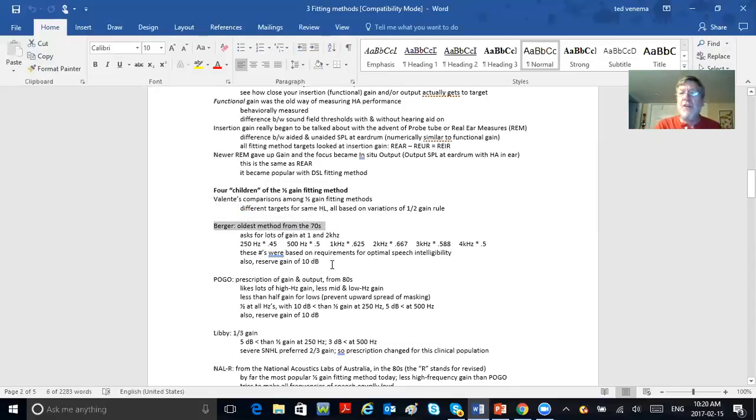lots of gain at 1,000 and 2,000 hertz. 250 hertz, multiply the threshold by 0.45. 500 hertz, multiply the threshold by a half. 1,000 hertz, multiply the threshold by a little bit more than half gain. 2,000 hertz, a little bit more than half gain. 3,000 hertz, still more than half gain. And at 4,000 hertz, half gain again. These numbers were based on the requirements for optimal speech intelligibility. And he also gave a reserve gain of about 10 dB that the guy could crank it up.